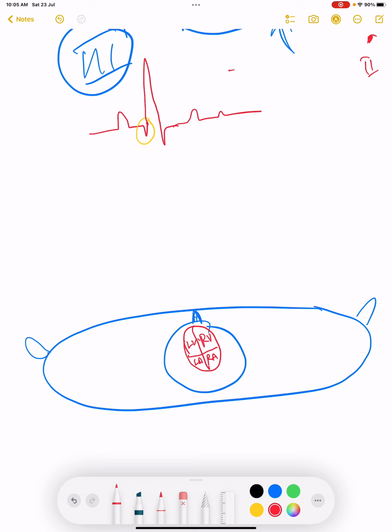Okay, so this will be the normal heart, and the position of the normal heart will change with the body position and especially with respiratory movement. For example, during inspiration, when the lungs come down, the heart will be more like this. The heart will be more anterior, so this shape of the heart will be most likely during inspiration. Okay, for example, this man is inspiring, taking a breath in, so what is happening? The septal depolarization is happening like this.